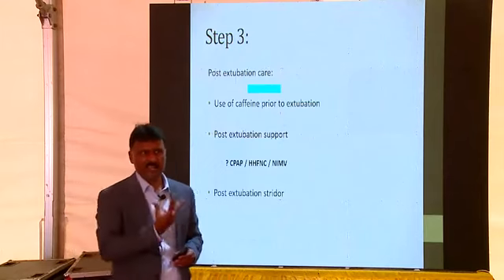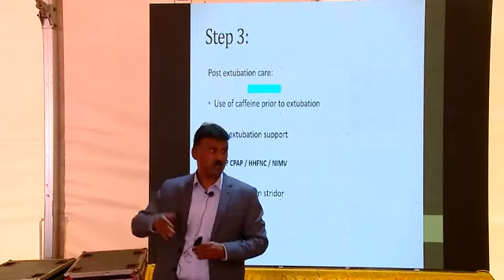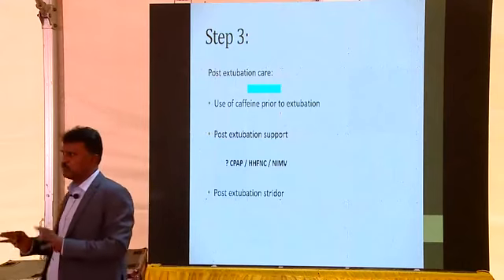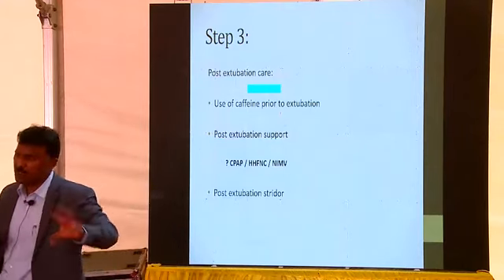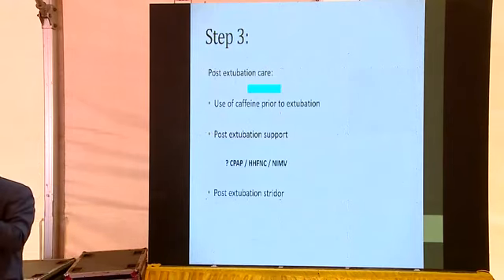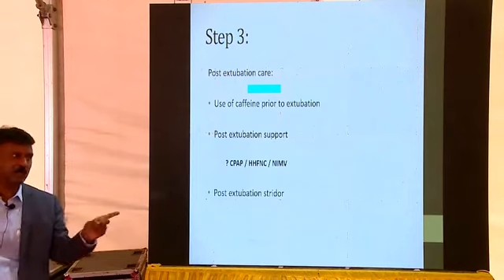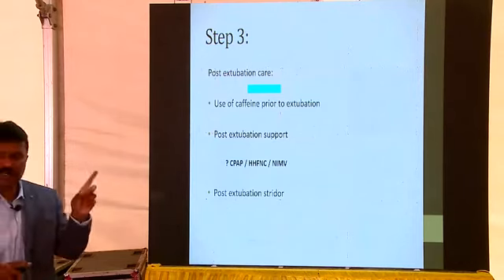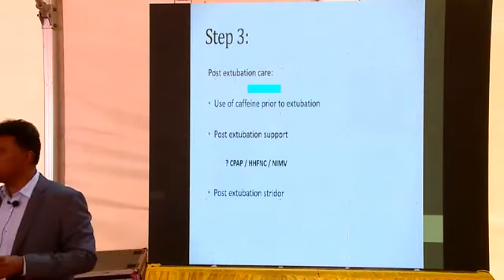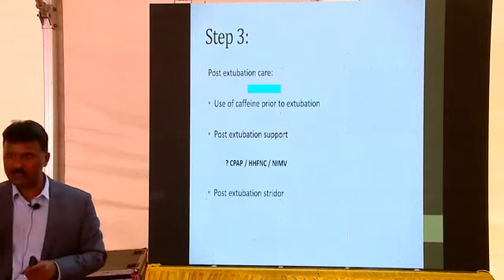It still has a residual lung, and your lungs require a good amount of support. This is something which people have tried. The baby is on CPAP, he's still having apneas. Instead of re-intubation, can I put on NIMV? Understand, the NIMV that we are going to give is not synchronized. It is not SNIPPV, not synchronized nasal intermittent ventilation. Most of the trials were done with an abdominal capsule. So nowadays they have NIMVs which can synchronize with the baby's breaths.